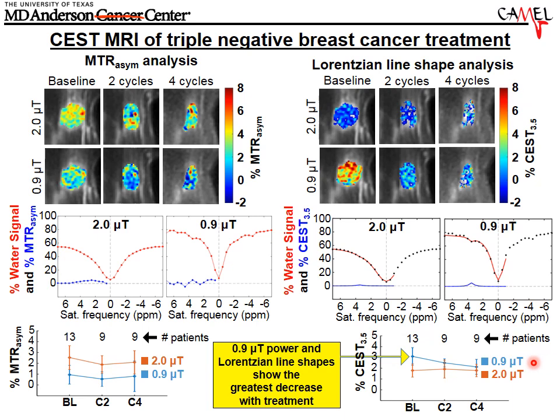Important point, if I were to come back to the slide just one last time, I would like to again emphasize that CEST MRI is dependent on protein content, the amount of amide protons that are present, and also pH. The amide protons will exchange at a faster rate as the pH increases, just like I described earlier. The protein content dominates the effect in the data, more so than the pH.